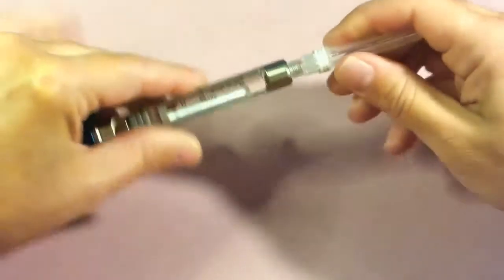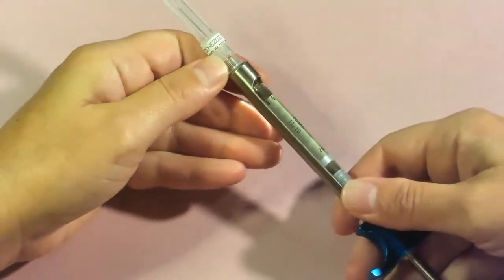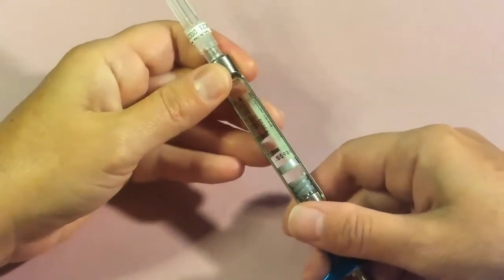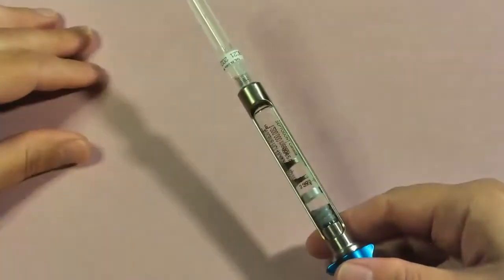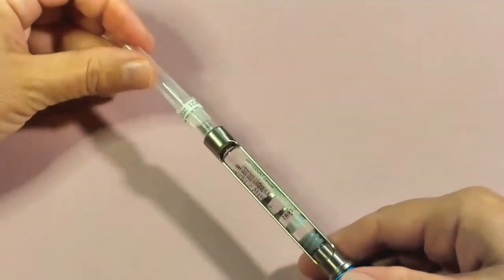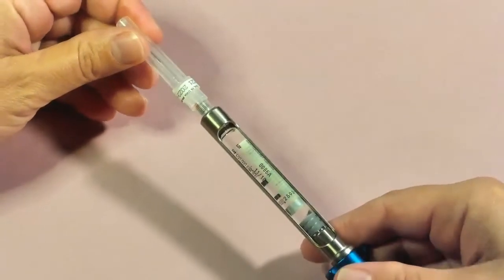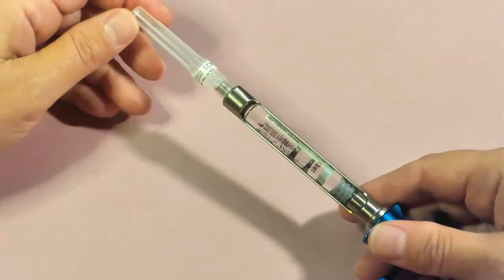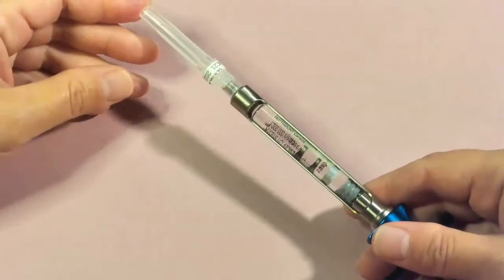On this needle we have a red dot, which indicates the bevel orientation. Once your needle is attached, test your armamentarium to make sure everything is working properly. You don't want to get into the tissue and then realize the anesthetic isn't coming out, because then you'd have to penetrate again — so we want to minimize the number of penetrations as much as possible.